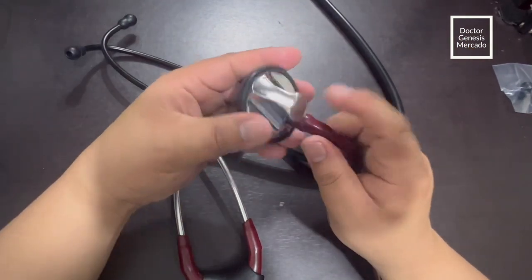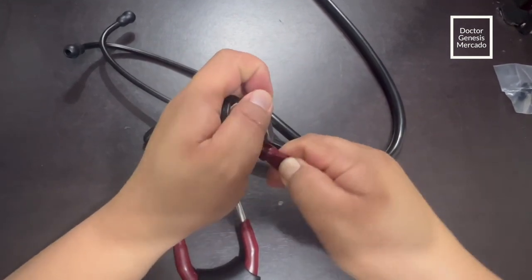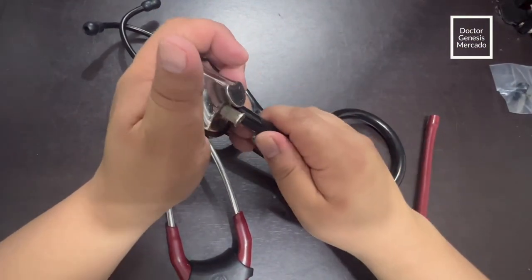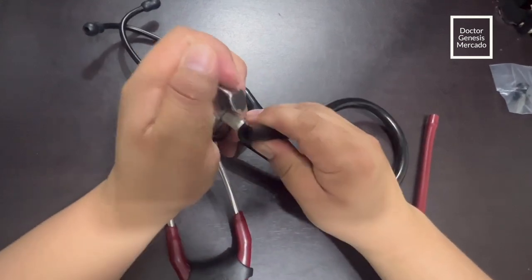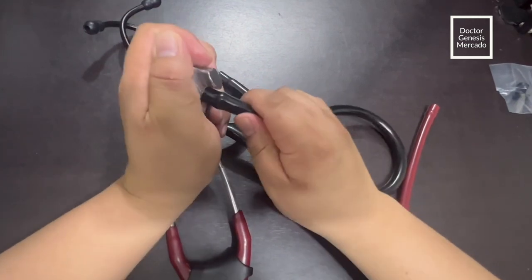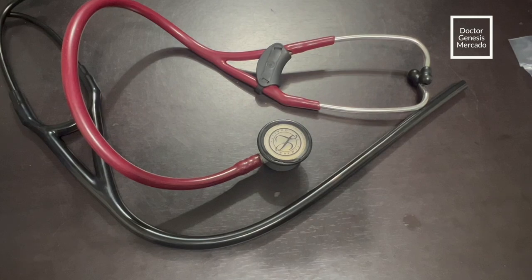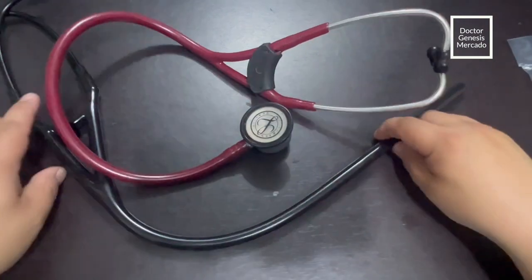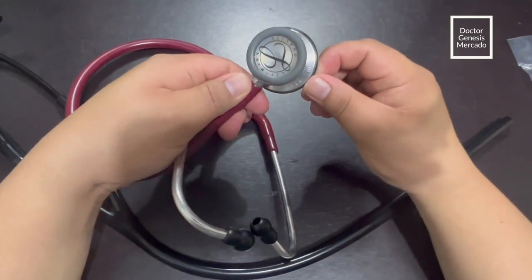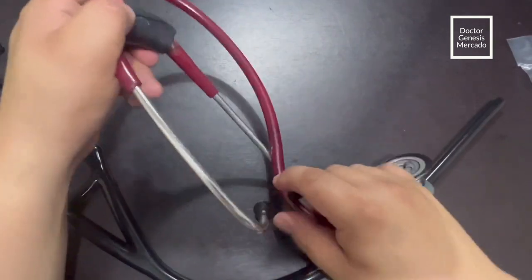Okay. So we will remove the tube from this one. And replace it. Okay. So yeah. Okay, so now we will use this tube on the chest piece of my Littmann Cardio 3. Okay, so this is my old tube, as you can see, this one.